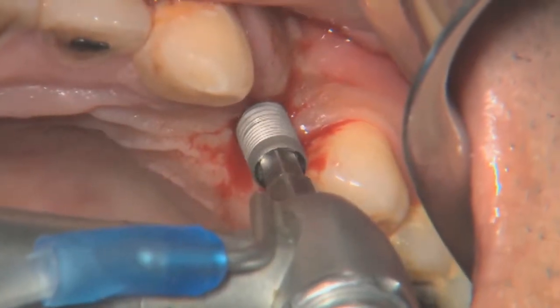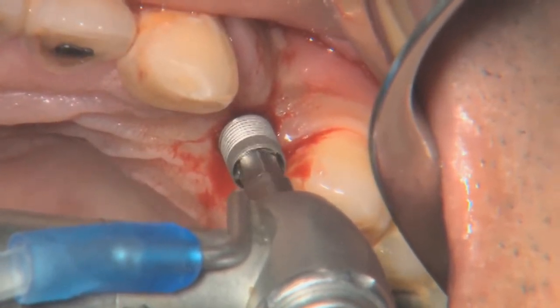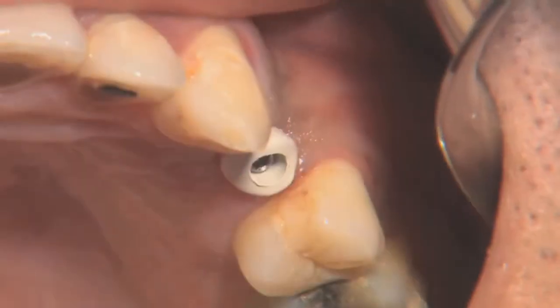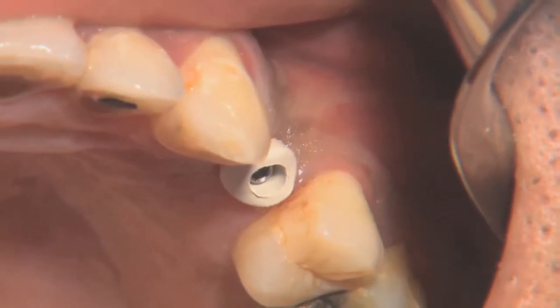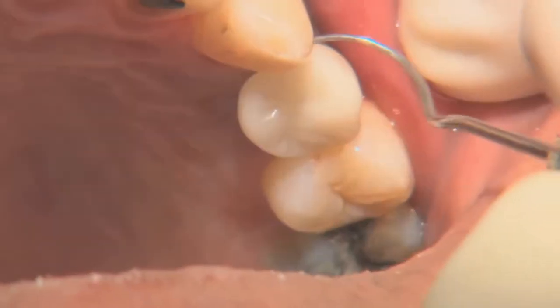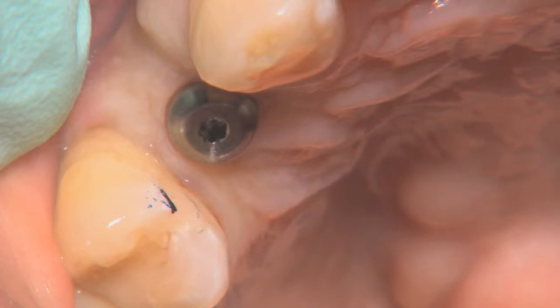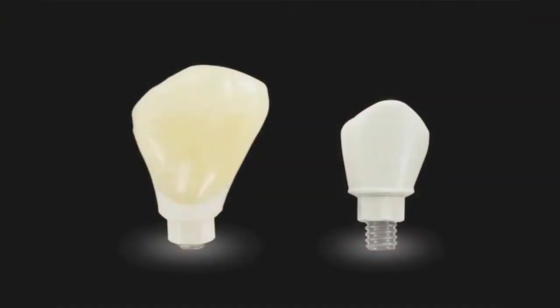With the next generation of the thought process comes the ability not only to determine implant positioning in the bone, but also to determine tissue contouring and immediate loading of our implants with transitional appliances, such as temporary crowns or bridges. Stock components that may or may not be adequate for proper tissue management may no longer be needed. Everything can be customized. Technology allows us to customize each case to determine the ideal tissue contour for each patient.